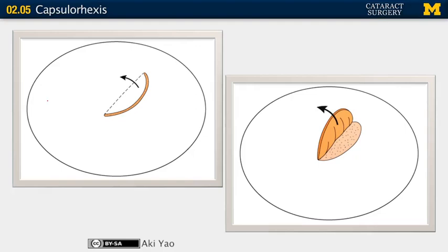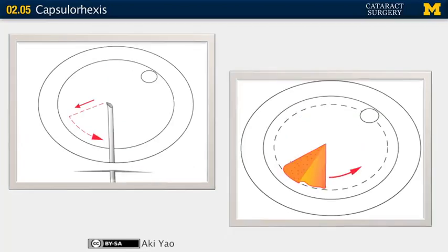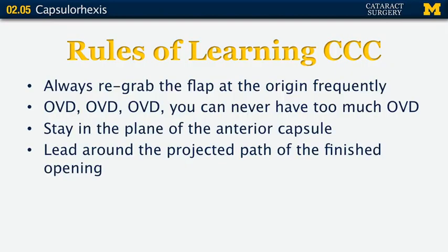There are many different ways to accomplish the same task. Some people creating a capsulorhexis are pushers — they make an opening in the center, drag, and then push up a flap, and start leading it around. Some people are pullers — they make an opening, drag, then pull up a flap and lead it around. Whatever you're most comfortable with works, because no way is wrong.